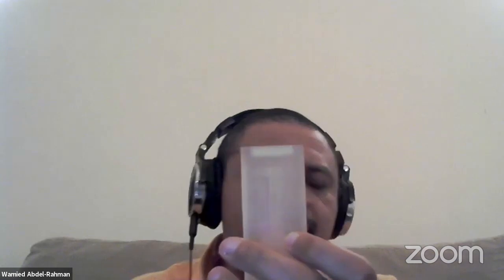This is our phantom. This is the one that we used for our project. So you see, here is where we placed a film.